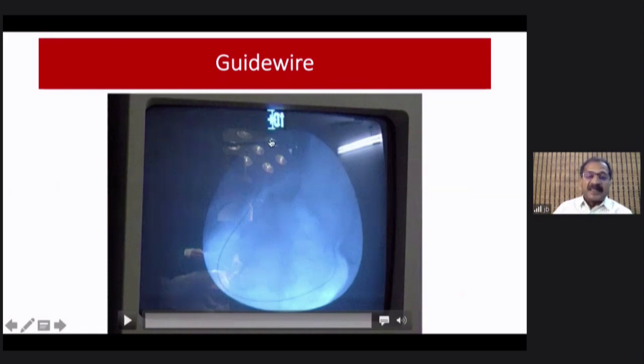And whether it has to be towards the left or right, some people prefer left, some people prefer right. If it is left, you have the colon, and the movement of the bowel is towards caudally, so the catheter will never be pulled back. I don't know whether it is really practically happening like that, but if you put it on this side, the peristalsis of the bowel will be upward, so it can theoretically drag the catheter up. So it will be a good idea to have the guide wire and the placement of the catheter like this.